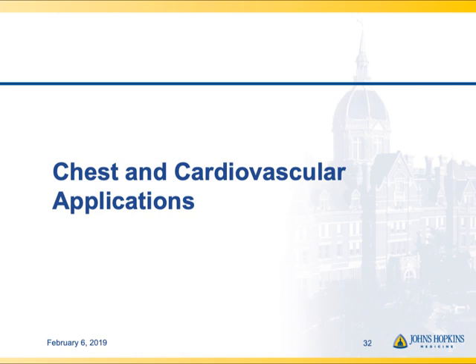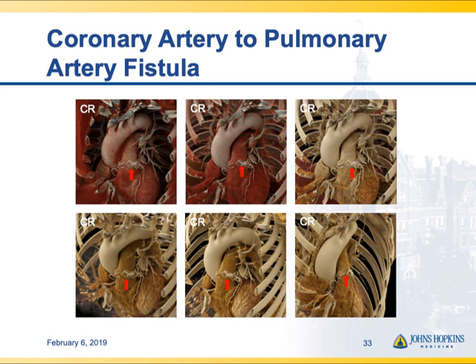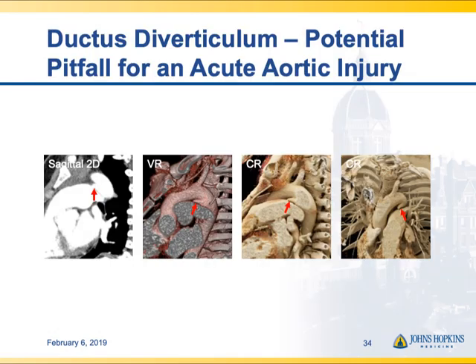Now I want to wrap up with chest and cardiovascular imaging applications. Here is a coronary artery to pulmonary artery fistula — apparently fairly commonly seen by cardiology colleagues at catheterization, but not often on imaging. With cinematic rendering you can see this fine mesh of vessels that wraps around the main pulmonary artery trunk.